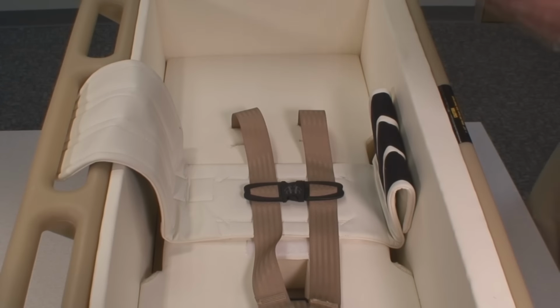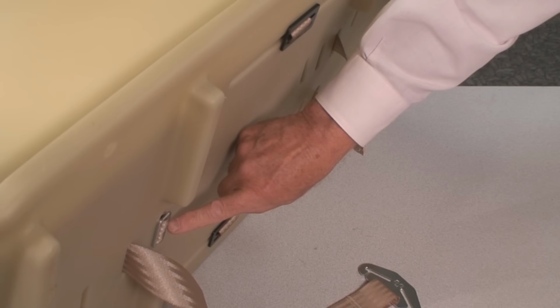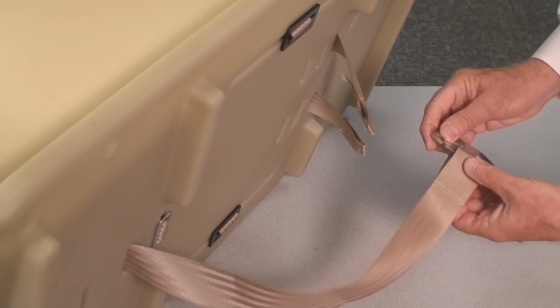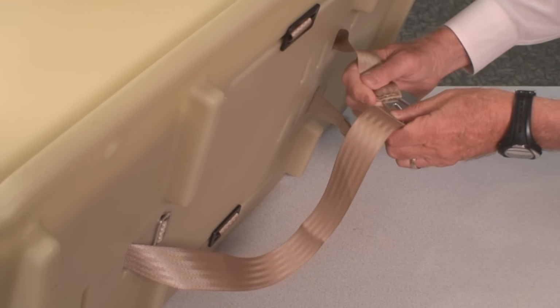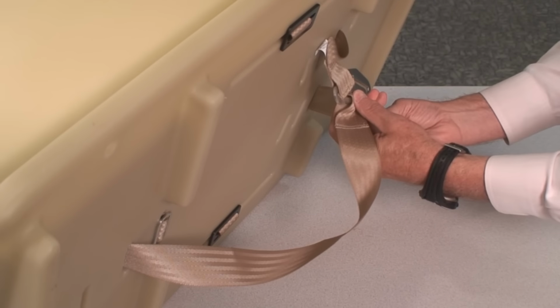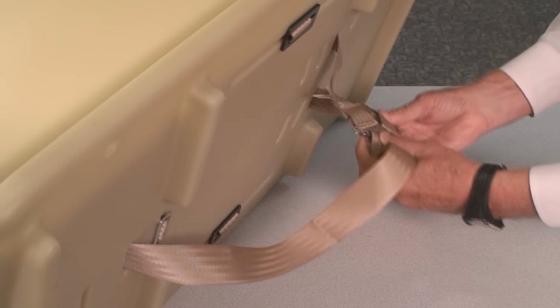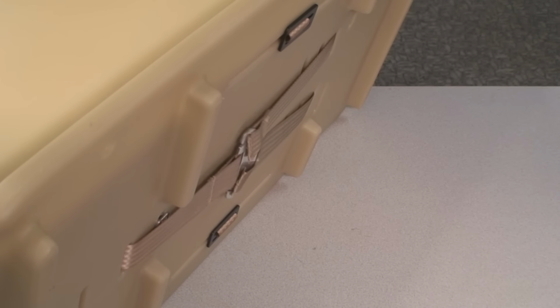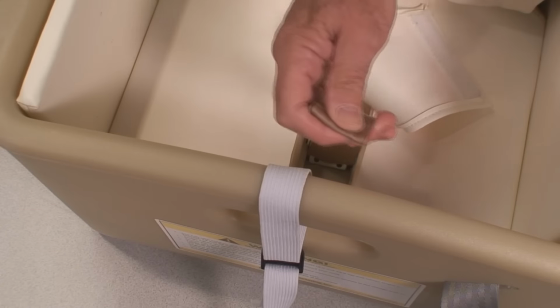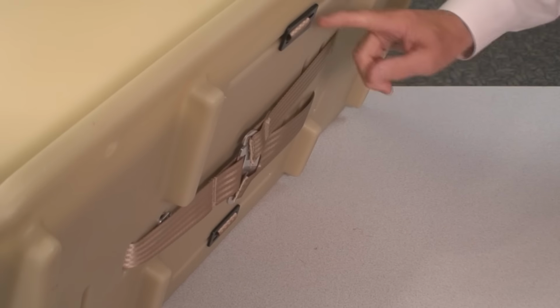Now you're ready to turn the car bed over and pull the harness straps through the bottom of the car bed. Check to make sure that the buckle metal anchor has been inserted through the slot and is locked in place. Now connect the metal splitter plate onto the harness loops. Slide the loops in place. Now pull the A-lock strap tight. As you can see, the metal splitter plate has been connected and the two metal anchors are in place for the cummerbund.